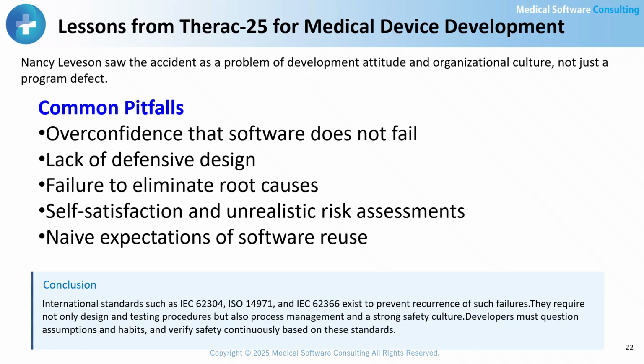overconfidence that software does not fail. Therac 25 had been in use for a long period without incident, leading to the mistaken belief that it was safe. But reliability is not the same as safety. Lack of defensive design. The system was missing mechanisms to anticipate worst-case scenarios and to monitor or diagnose internal states. Failure to eliminate root causes. Fixing defects in a piecemeal way cannot ensure the safety of the overall system.